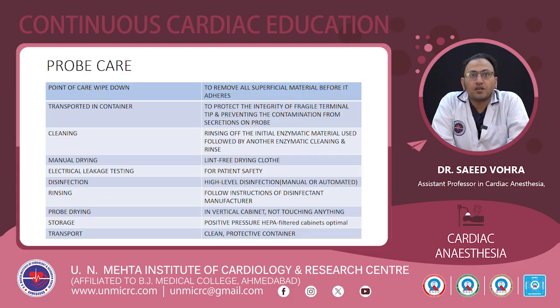Now, cleaning is done with enzymatic material, followed by another enzymatic cleaning and rinsing. Manual drying: a lint-free drying cloth is to be used. Electrical leakage testing for patient safety. A high level of disinfection, whether manual or automated, is used. For rinsing, the instructions of the disinfectant manufacturer are to be used.